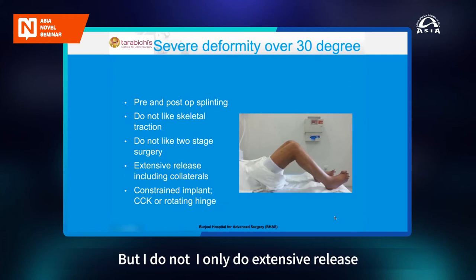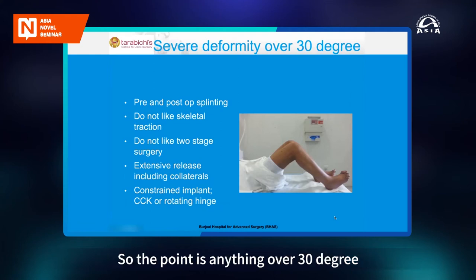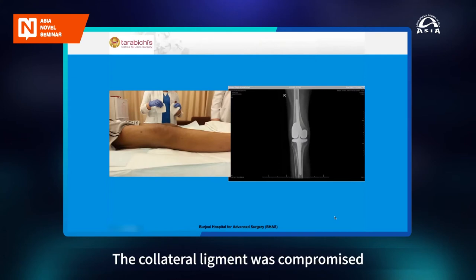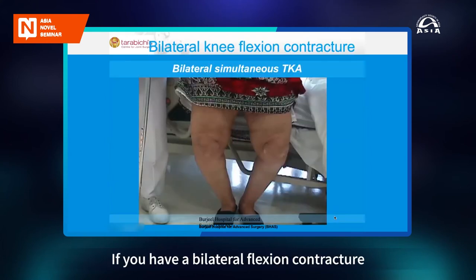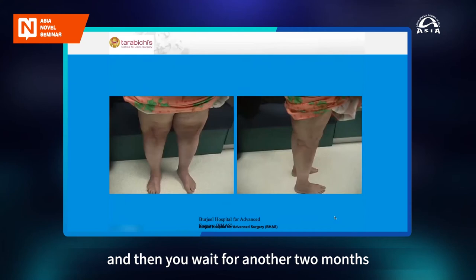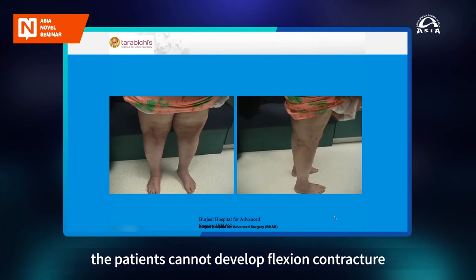I only do extensive release, and sometimes you have to do a release of your collateral ligament and then end up using a CCK or rotating hinge. So the point is, anything over 30 degrees, get your CCK and rotating hinge implant, because a lot of times, like in this case, yeah, I got it straight, but guess what? The collateral ligament was compromised and I had to use a CCK. If you have a bilateral flexion contracture, please do both knees together. Because if you do one and then wait another 2 months, postoperatively the patient is going to develop flexion contracture.